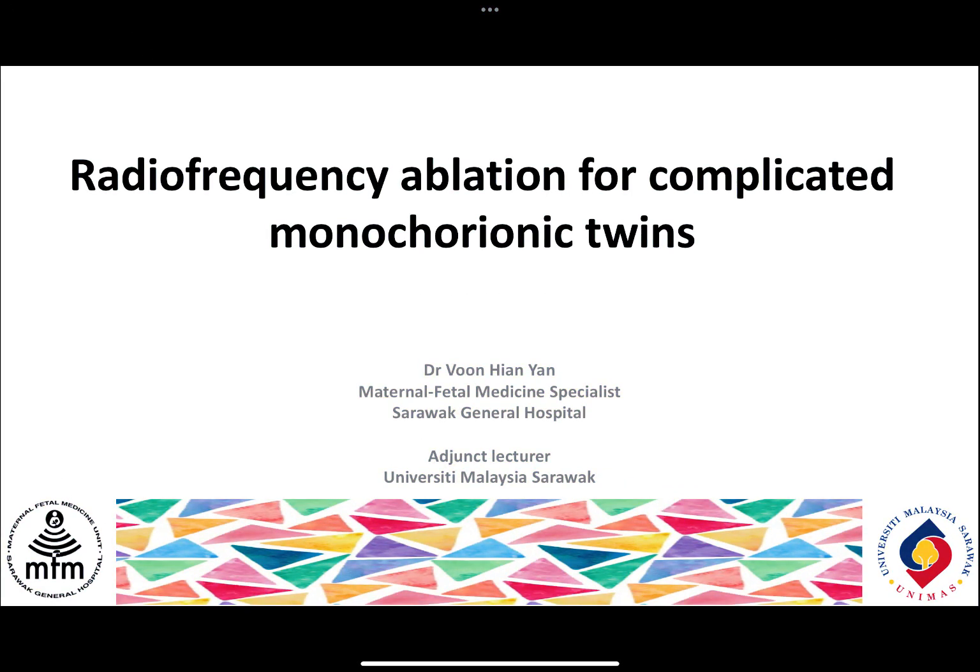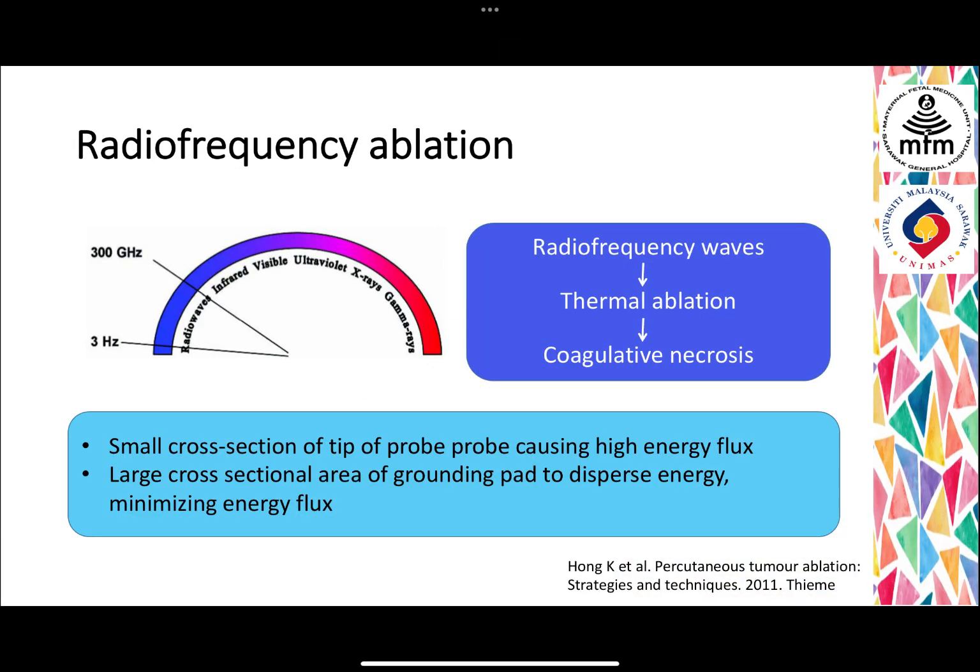Welcome to this introductory video on the use of radiofrequency ablation in obstetrics, or RFA. My name is Dr. Voon. Briefly, RFA involves the generation of heat and subsequent coagulative necrosis through radiofrequency waves.